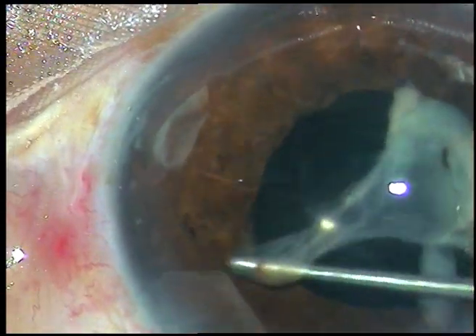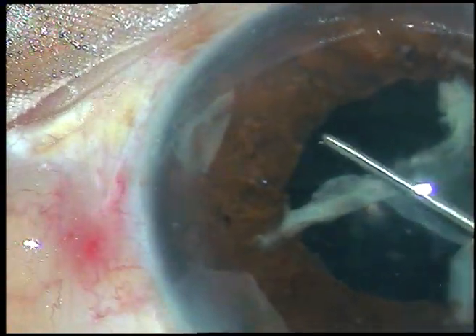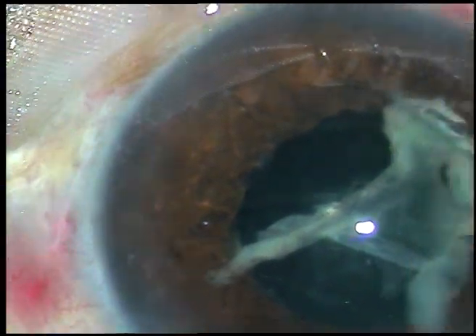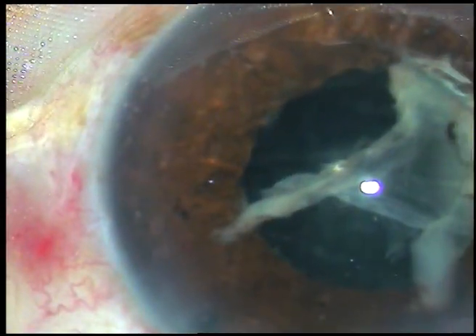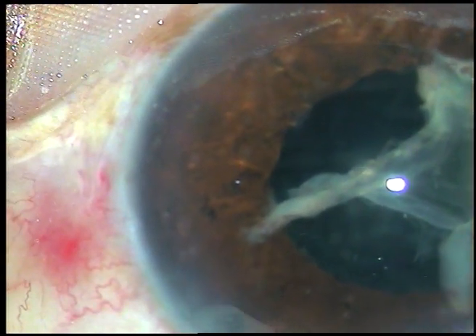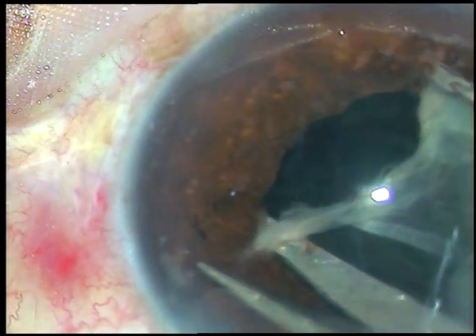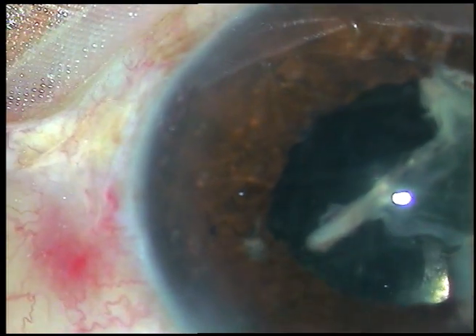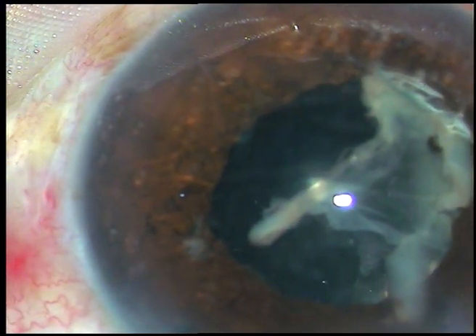This membrane is firmly adherent at 2 o'clock to a point on the iris. If I pull the iris, the iris may get torn — iridodialysis can occur. So I have asked for Vannas scissors. Viscoelastic is injected, and I am cutting this band at its attachment to the iris.